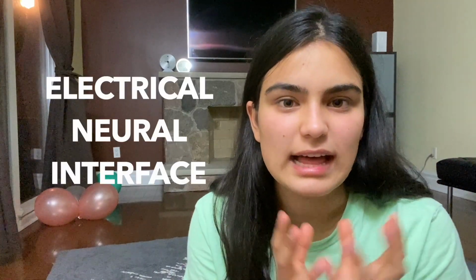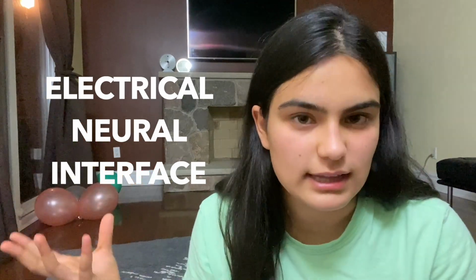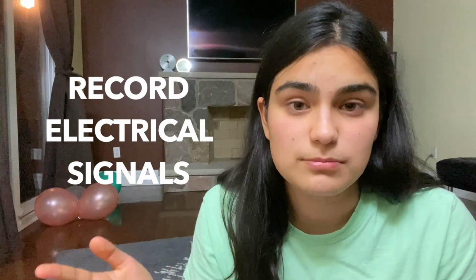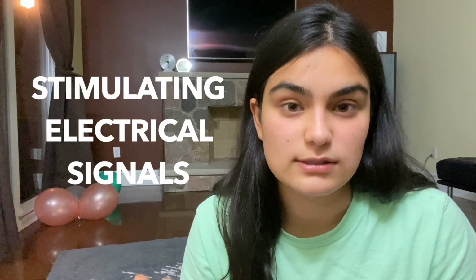I wanted to film a video getting more in depth on neural interfaces, and I want to explain one of the core tenets of how to build an electrical neural interface. This is the type of neural interface you see Neuralink building. It's the type that most researchers deal with to be able to record electrical signals from the brain, whether that be action potentials or other electrical oscillations, or stimulating electrical signals into the brain to be able to stimulate neurons and make them fire.